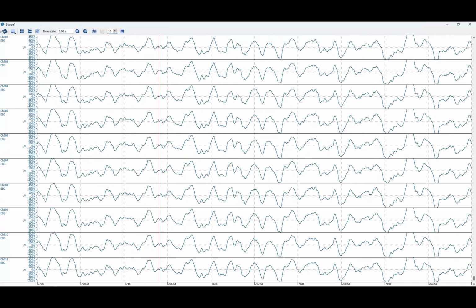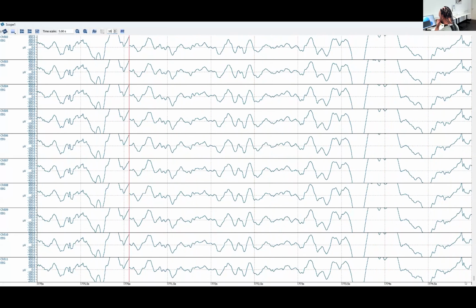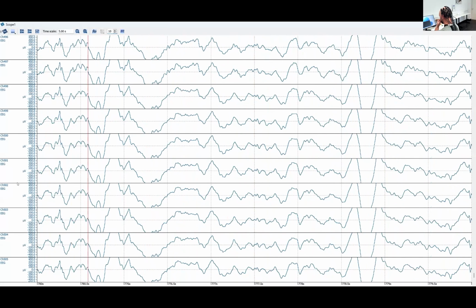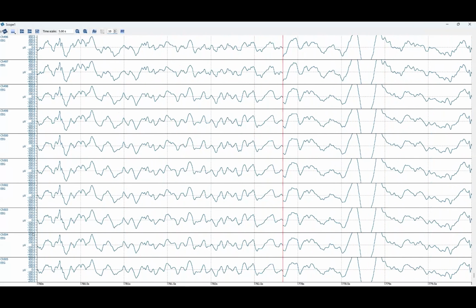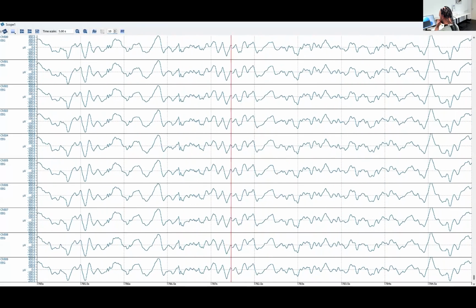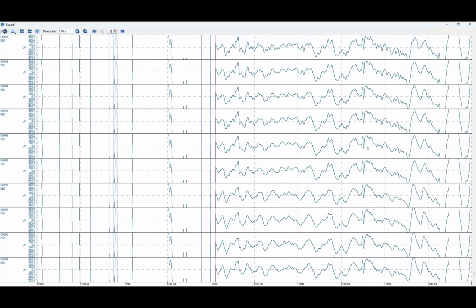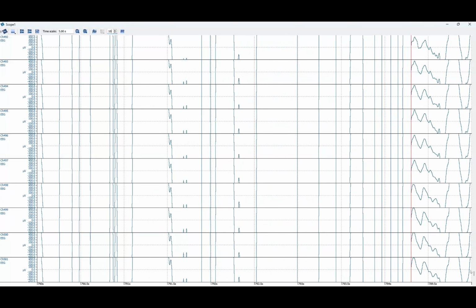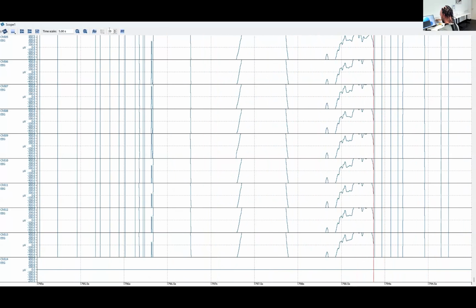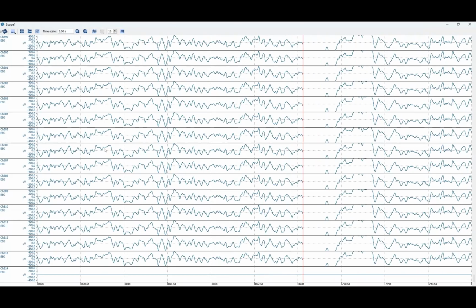So it's 512? No, that should be number 1. But with the common average reference. Sure, but the CAR is taking the average of all the electrodes. Yeah, let me check that. Maybe you can just show the last grid. Yeah. It's exactly this one here. So if I show... You see also this channel. Show all the channels.